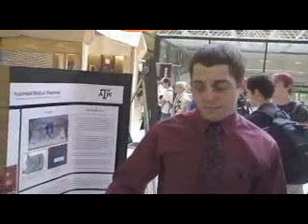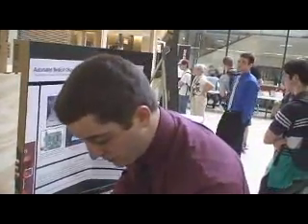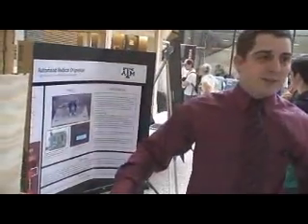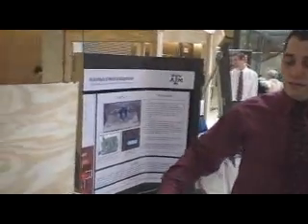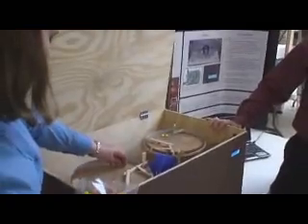Can you run the same thing again? So if you wanted to deposit 5. Okay. What happens when you run out? Then it's just gonna keep going. We didn't really get that debugged in the program. So you don't track it. We didn't get that.